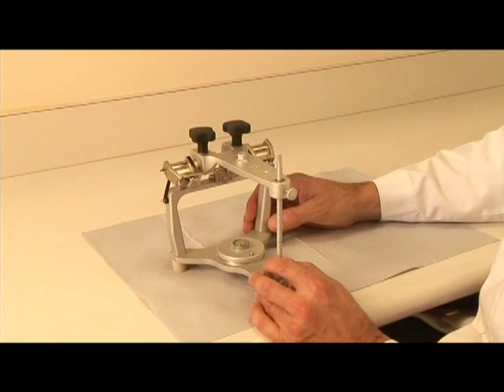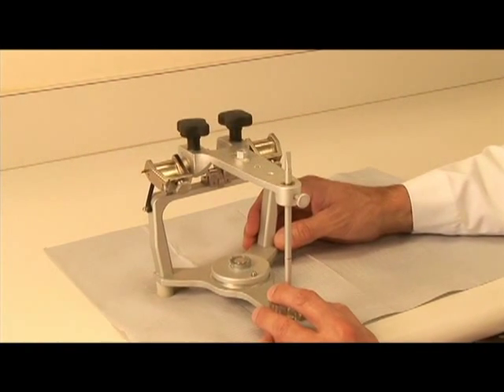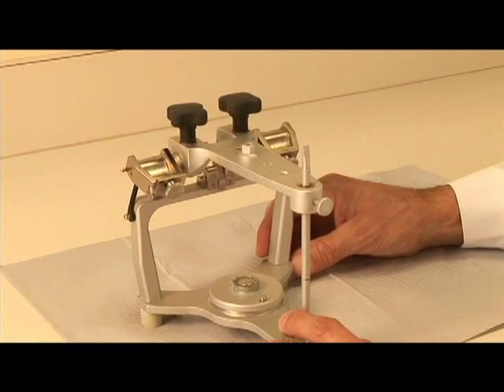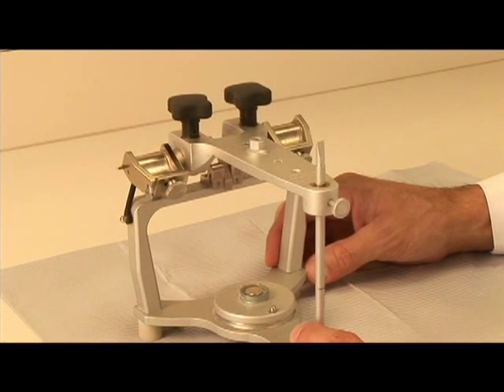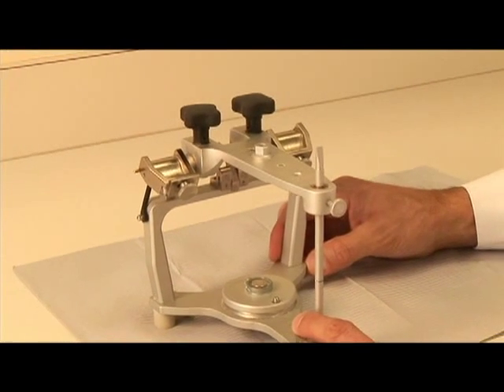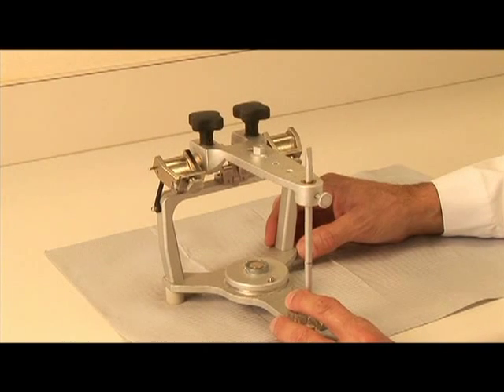We're going to get ready to mount the casts that have been generated from the diagnostic impressions that were made previously. Two stone casts have been poured and trimmed. We'll use those later, but in getting the articulator ready, we need to make sure that there are certain settings that are in the correct position prior to mounting the maxillary cast to the face bow.